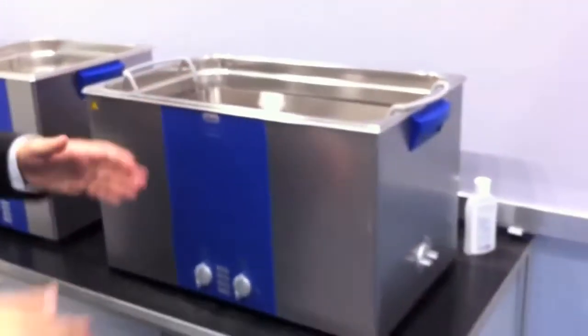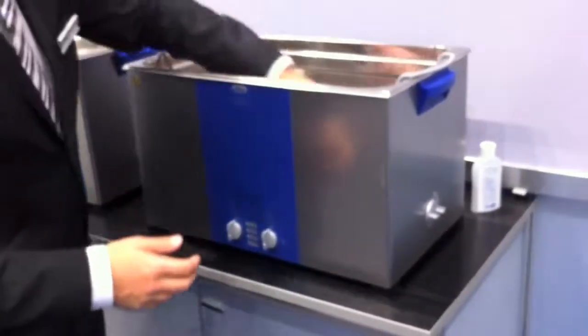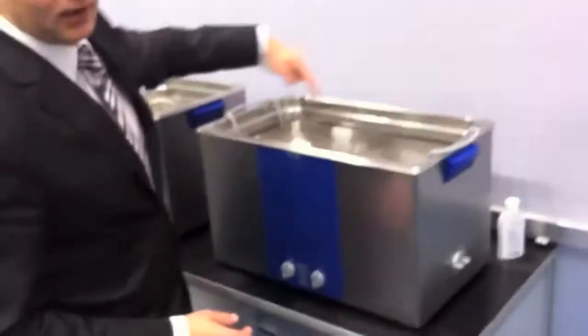Last but not least, this is the S300. The S300 has the dimensions of a normal Dean basket, so as a consequence you can clean three Dean baskets at the same time in one machine.